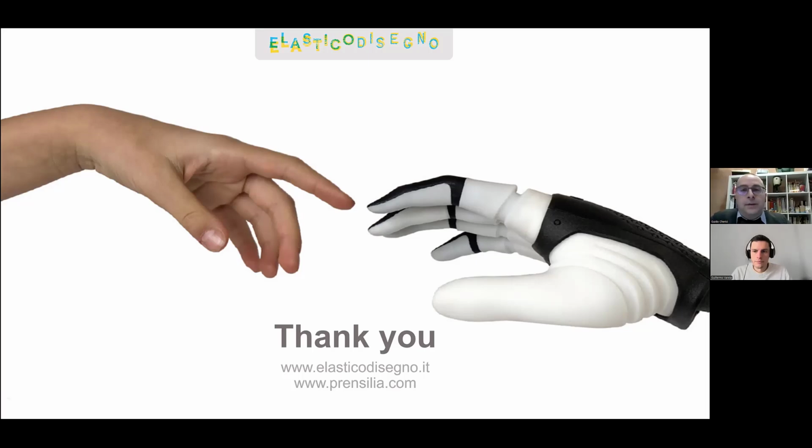And based on user feedback, they noticed that they need a little more grip on some areas of the fingers, a little less on other areas. And so we've been adjusting or improving the shape of this overmolding over time. So yes, the hand is constantly evolving. This was the very first version of the glove, where the silicon glove had a tendency of cracking or breaking up in a few points. So we modified the folds and the shape to improve durability. So it's a constantly evolving project.